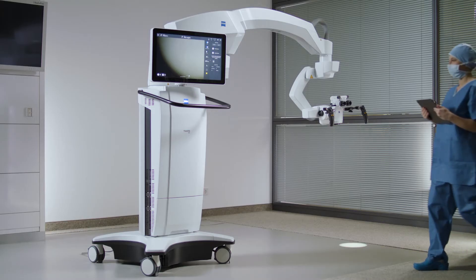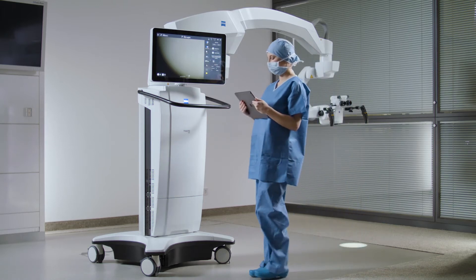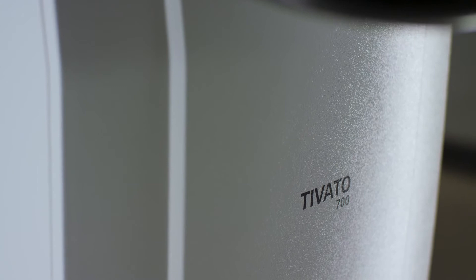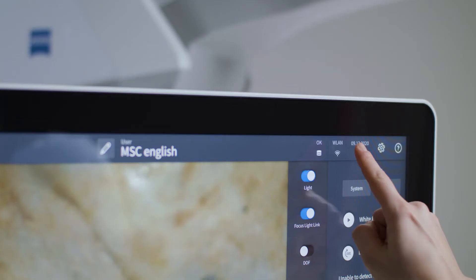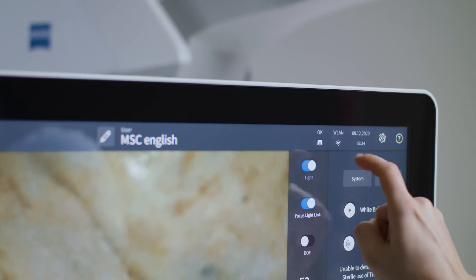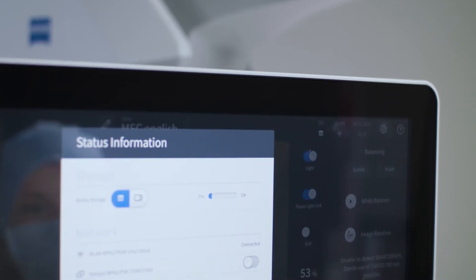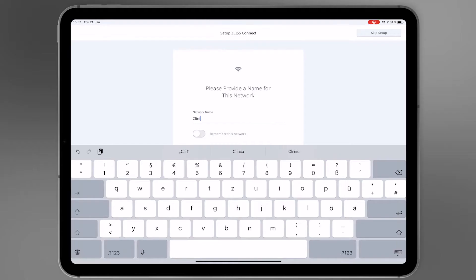Go all digital with the new Zeiss Connect app to digitally manage surgical data. Tivato 700 from Zeiss and the Zeiss Connect app are connected via Wi-Fi. Both must be in the same network, either in the hospital network or connected to the integrated hotspot. Connect the iPad to the appropriate network.